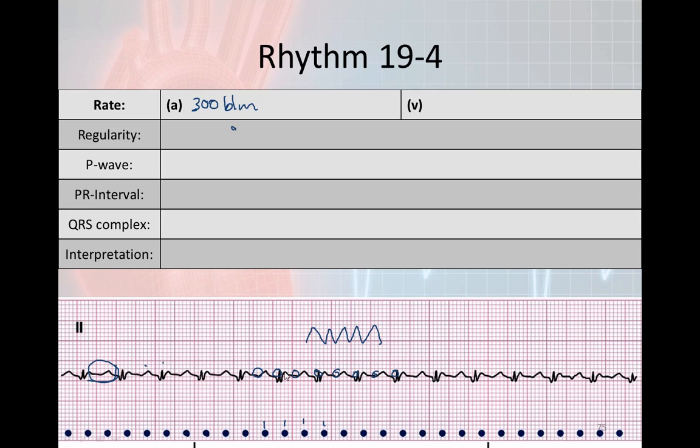So we've now kind of identified that this is an atrial flutter. Might be kind of tough to tell, but you can kind of see it. But let's go ahead and get our ventricular rate here. We start here at 300, 150. It looks like 300, 150, exactly 150 beats a minute. Regularity, and if you take your calipers and march it all the way from the front side of the strip to the back side of the strip, you actually will be very regular.